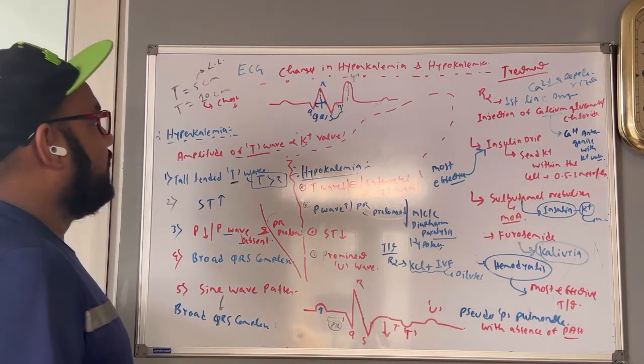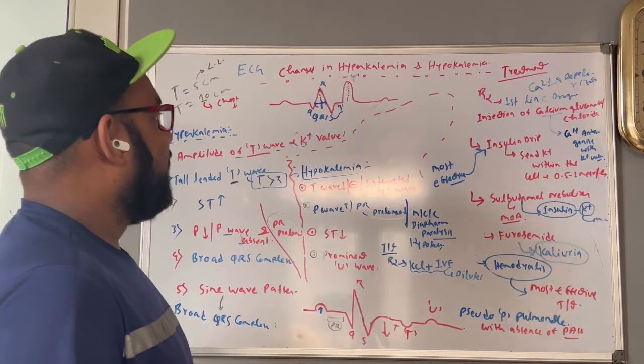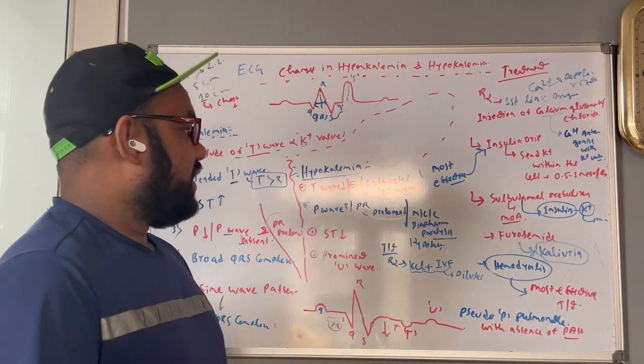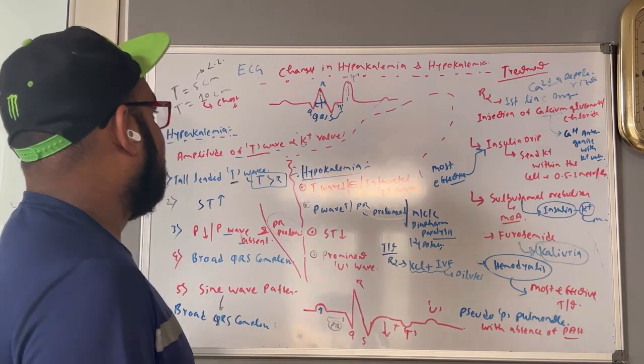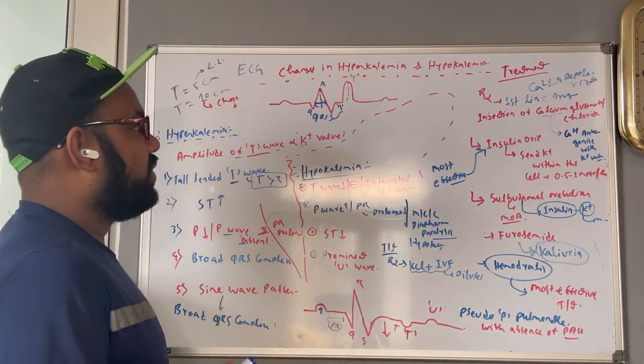This is all about the diagnosis, treatment, and ECG pattern in hyperkalemia and hypokalemia. In the next part I'll talk about multifocal atrial arrhythmia, where I'll also talk about a few points related to potassium level.